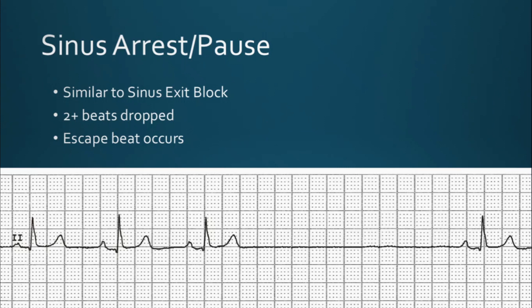In this example, let's march them out. You can see the end beat occurs a whole large box away — that will be your escape beat. You can see your two dropped beats: the QRS was supposed to be here, and here, and here. This is going to be your escape beat right here. So: drop, drop, escape beat.